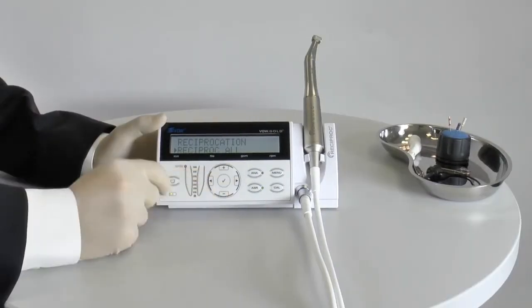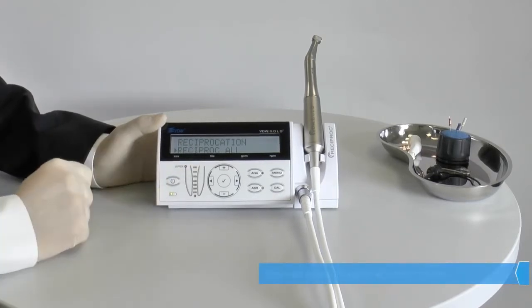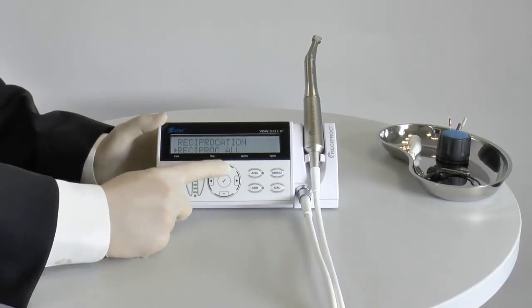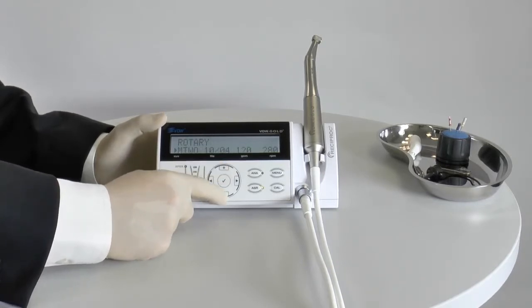You can pre-select a file system with the help of the navigation pad. The VDW Gold Reciproc incorporates the reciprocating file system Reciproc from VDW as well as all major rotary nickel-titanium file systems.